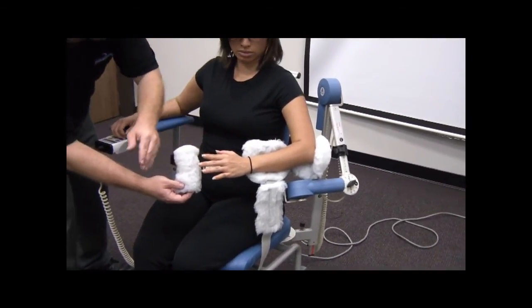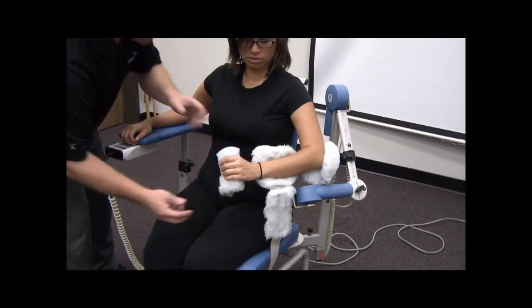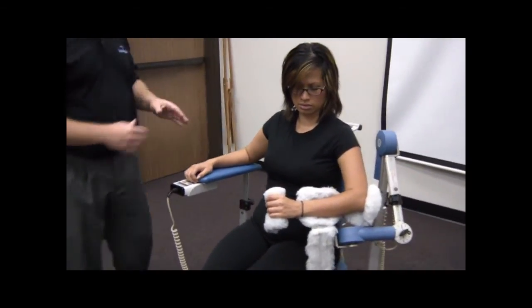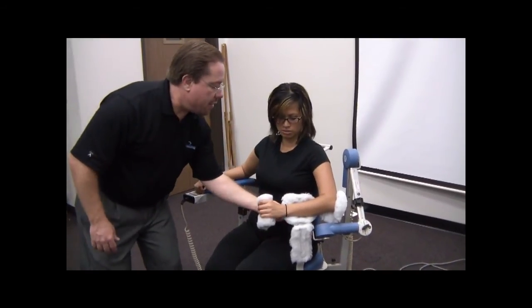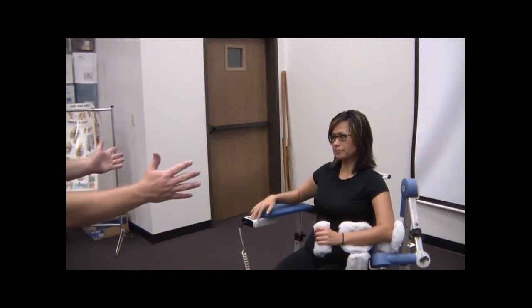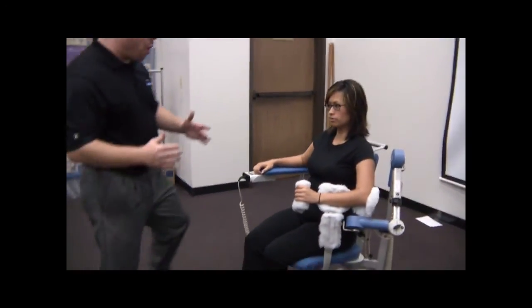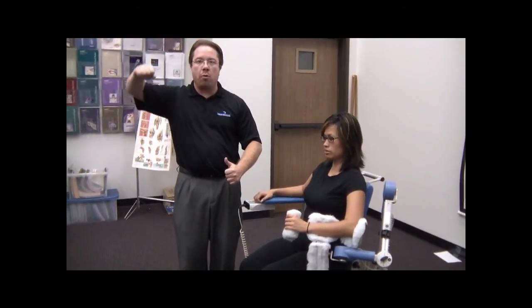We don't want it to bring her away from this. We don't want to jam her thumb. We just want it at a comfortable level for her to be able to be against the backstop and grip the handle, and then we can lock that into place, okay? So looking at her, that is perfect. And again, all we want to do with the patient is adduction and abduction in a normal manner.